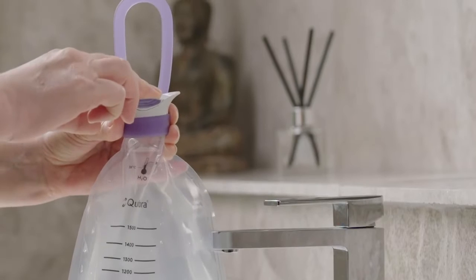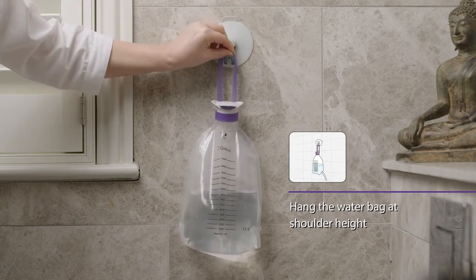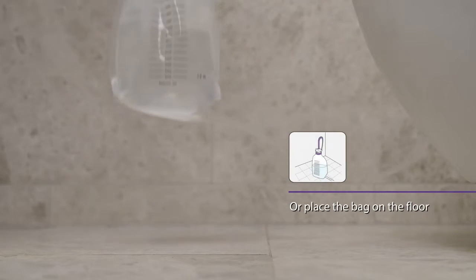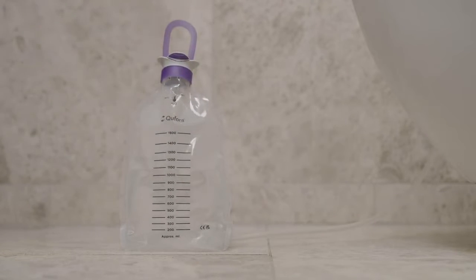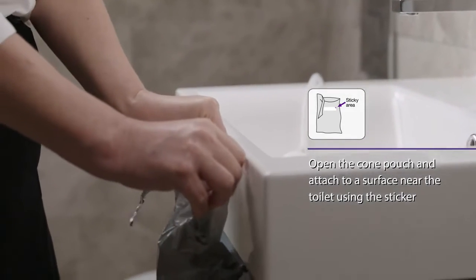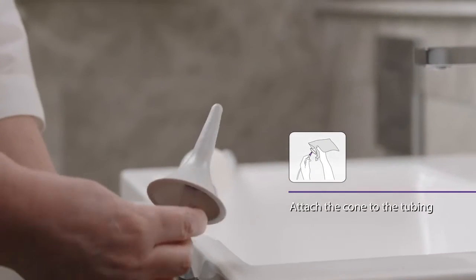Close the flip lid. Hang or place the water bag at shoulder height when seated on the toilet. The supplied hook can be used to hang the water bag on the wall. Alternatively, you may wish to place the water bag on the floor. Open the cone pouch and attach it to a surface near the toilet using the sticker. Attach the cone to the tubing. The system is now assembled.